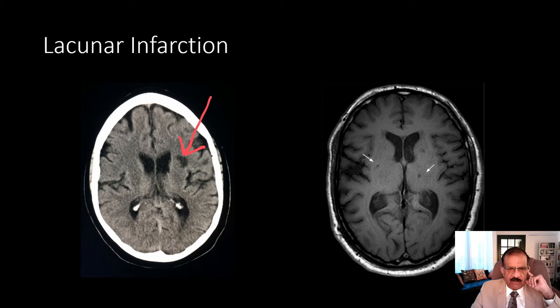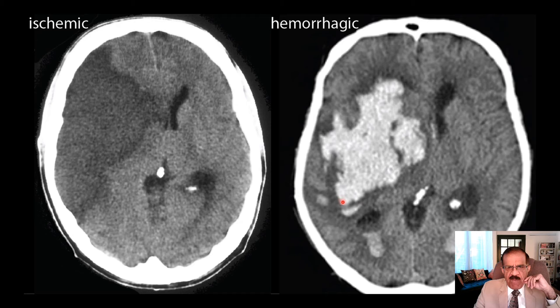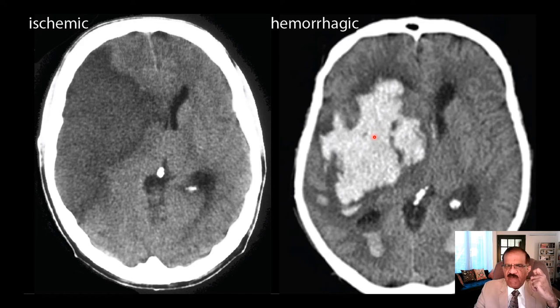Now, comparing infarction with hemorrhage: this big, very hyper-intense, irregular-shaped opacity within the brain is very different from infarction. Unlike infarction, which affects one entire territory of the middle cerebral artery, this one — although in the territory of the middle cerebral artery — is not affecting the entire territory. This is actually a hematoma where some branch of the middle cerebral artery has ruptured.